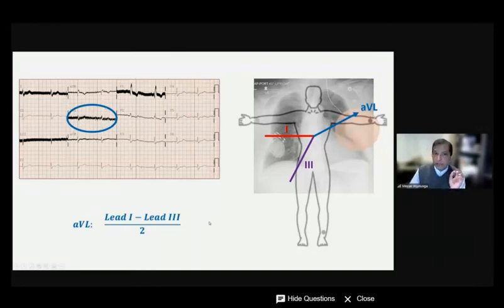But the point here is this: by purely looking at this, it can look like a tremor artifact, but it's too high frequency to call it tremor, and it's confined to certain leads. And just out of curiosity, I looked into what was going on with this patient, and this was the reason. When you turned off this pulse generator, of course, the patient didn't feel well because his Parkinson's symptoms recurred. At the same time, the ECG artifact disappeared. So that's question one. I didn't want to trick you, but wanted to take you through those lines.